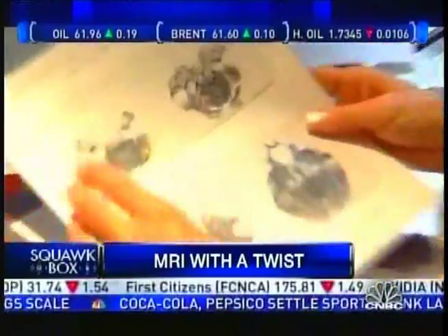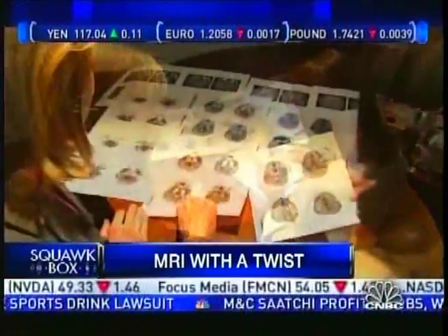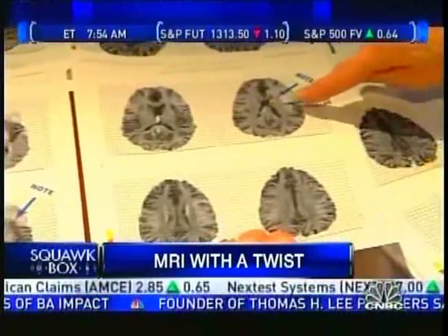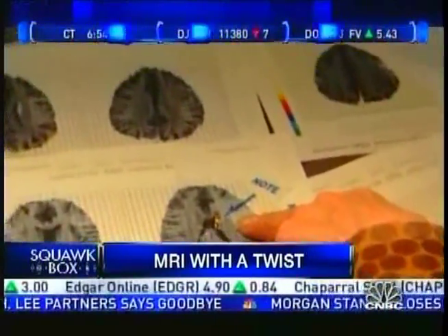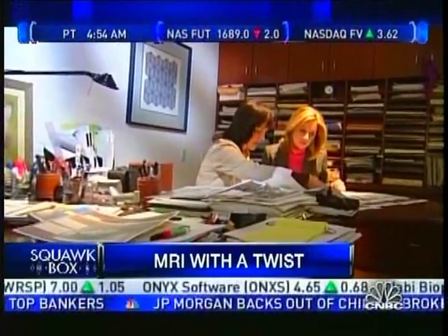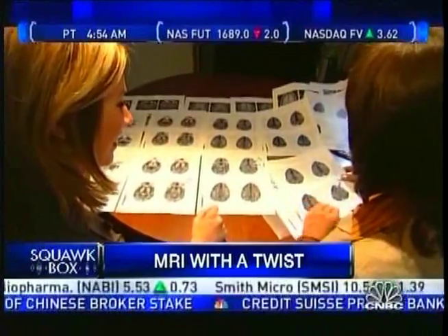That's not the case a few minutes later. This is the deceiving brain. At first, the brain looks the same. The real story starts when we get about to the middle of the brain. And we see this slice here is comparable to this slice. And remember, there's nothing happening here. Nothing when you're telling the truth. But when I lie, the activity goes off the charts. You are a normal liar, loud and clear.